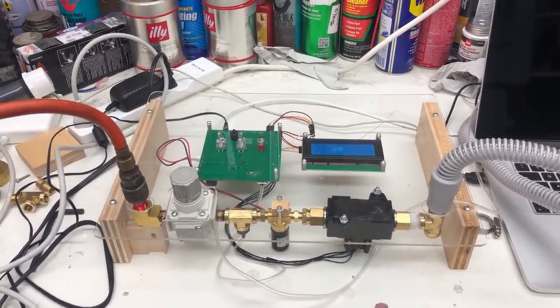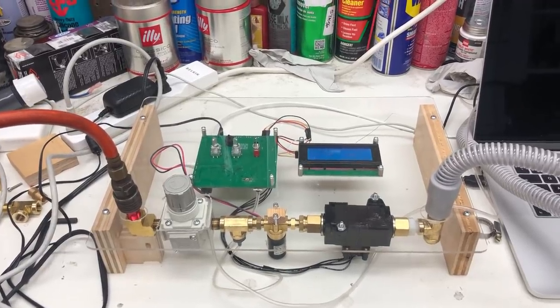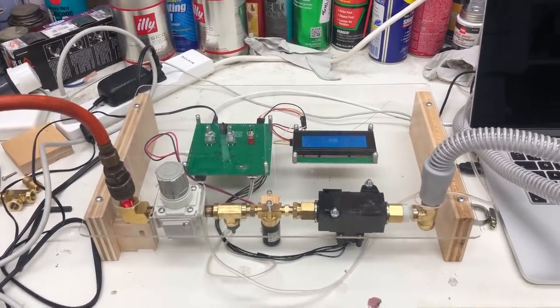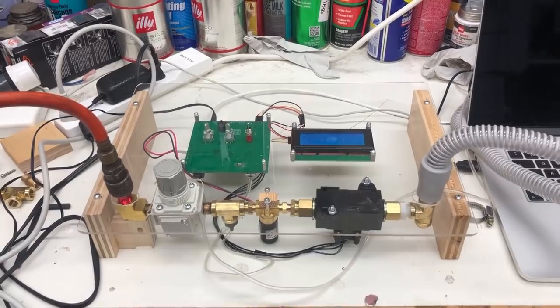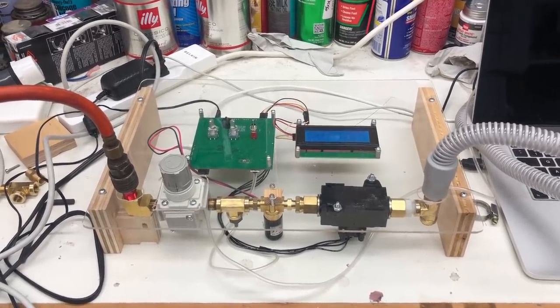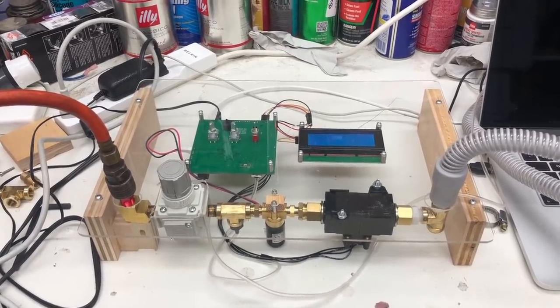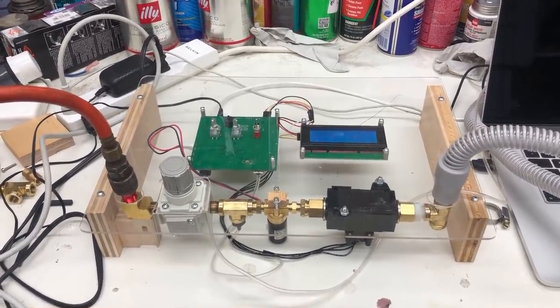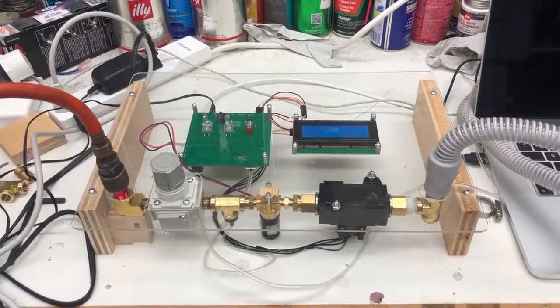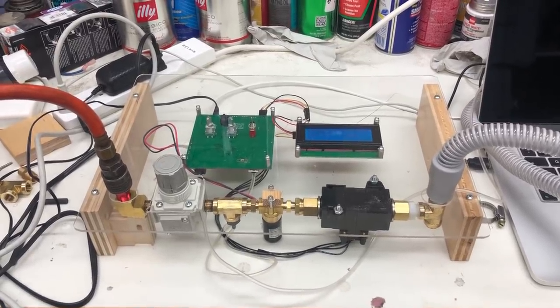These patients may have acute respiratory distress syndrome with very low-compliance lungs. Therefore, it's necessary to very precisely meter both the flow and the pressure of air being delivered to the patient so that if the patient's lungs build up too much pressure due to their low compliance, the flow backs off to avoid harming the patient.